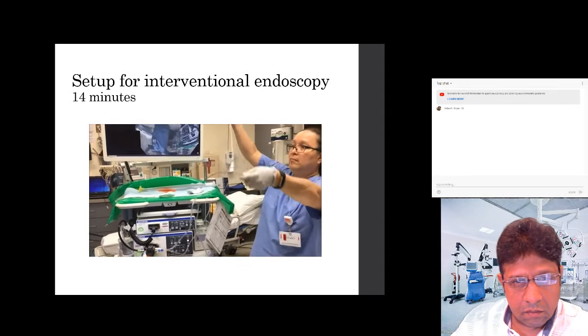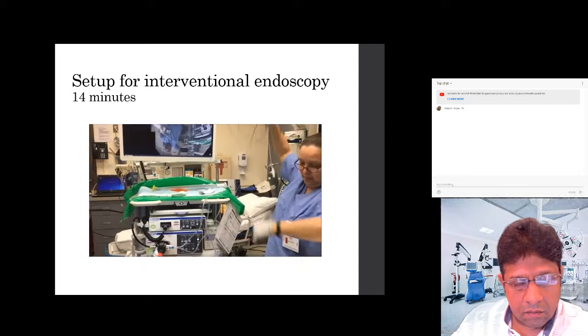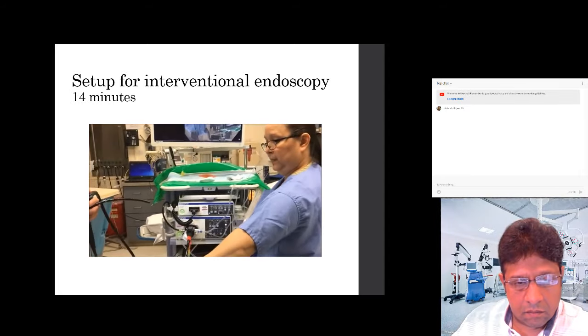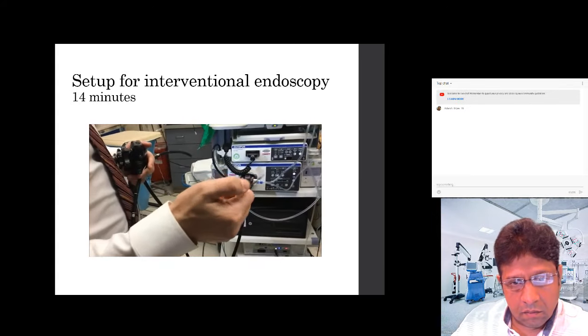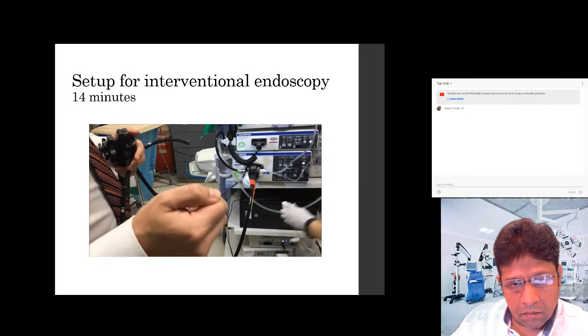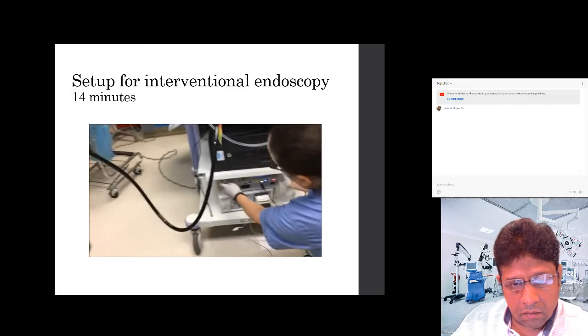And sometimes for bleeders, we're using all of these modalities. You know, you have to put a clip on, it's still bleeding, then you want to burn it. So okay, here I'll take this. Here's the tip, and you can see the little coils on the end. That's what's going to burn the actual vessel.